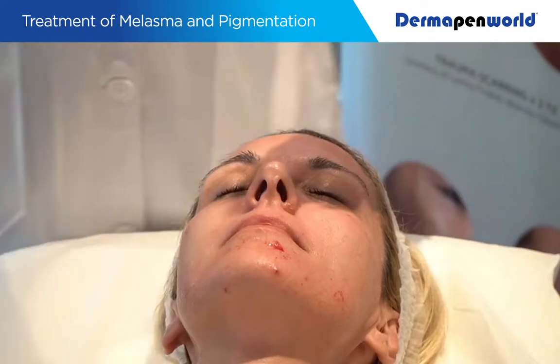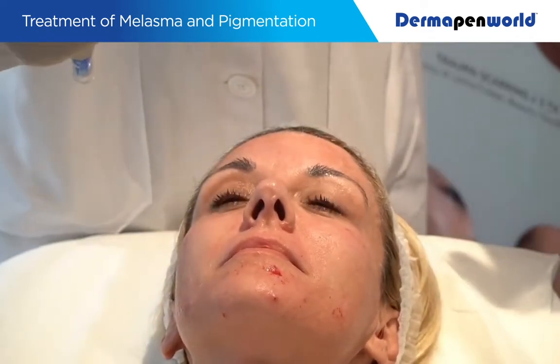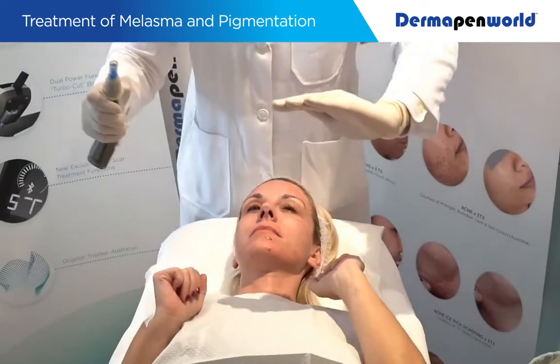Done. So, I get you to open your eyes. With one hand, this takes a little bit of practice. I'm going to get you to unroll the sleeve. Don't touch. Do you want some gauze?